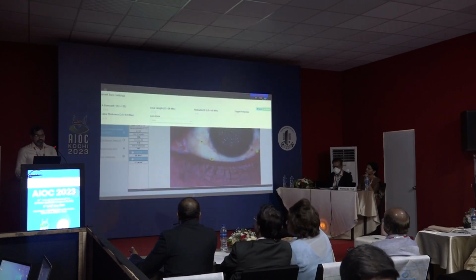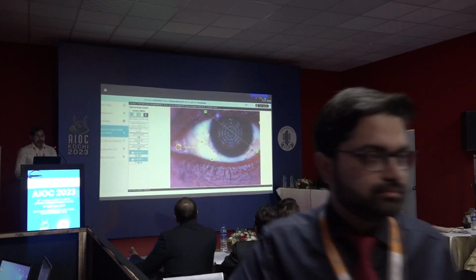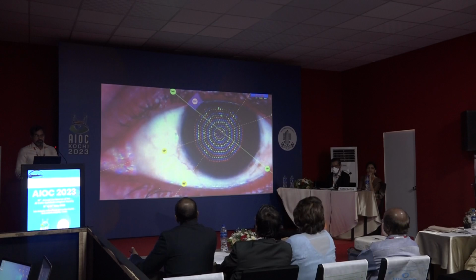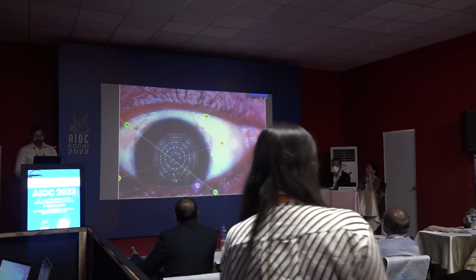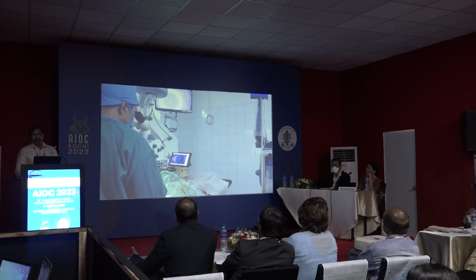Press the pencil icon to enter biometry data: axial length, ACD, and lens thickness. The axis of alignment at 147 degrees is displayed as a green line, and site of incision at 136 degrees in the form of a pink highlighted area. Identify two prominent limbal structures. Click on it. The system will display their axis. It is 17 and 50 degrees in this case. Save the picture, rotate it as needed, and use it intraoperatively to identify landmark points under microscope.